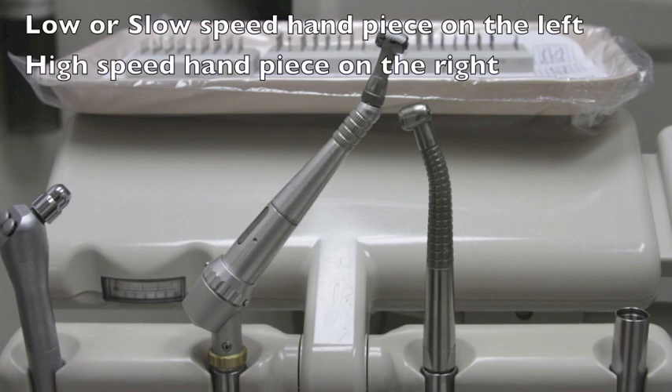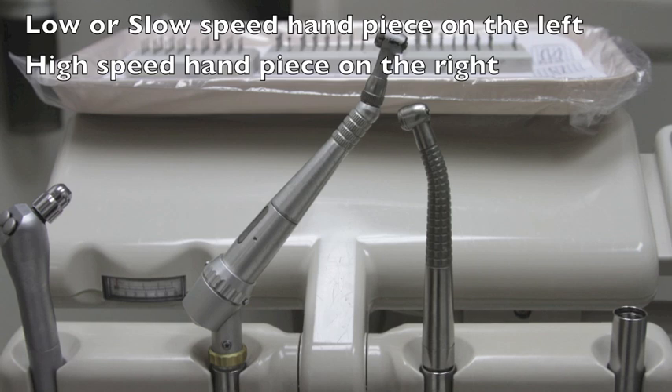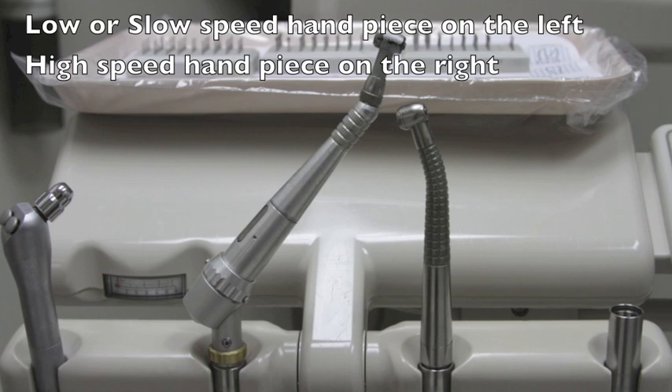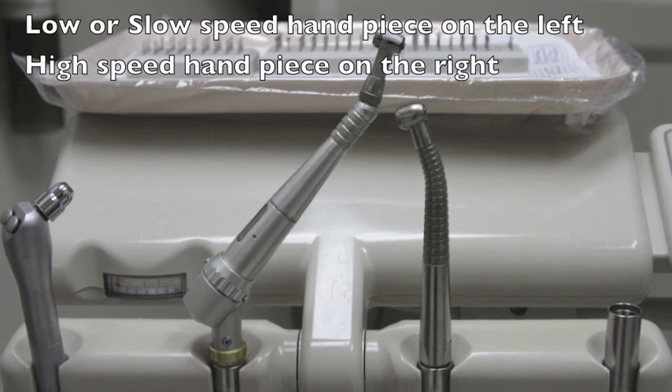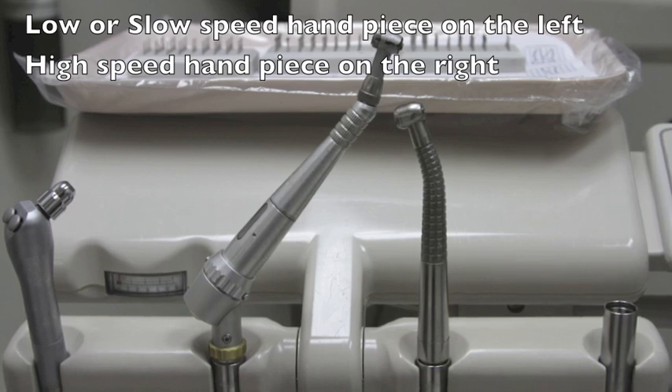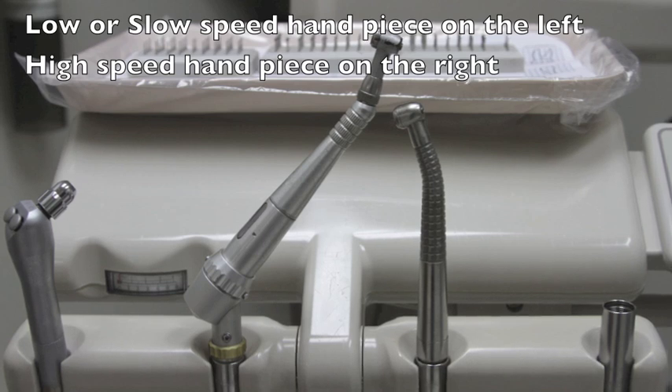Next we'll be looking at handpieces. As illustrated here, there are two common in dentistry. On the left is the slow speed handpiece and on the right is the high speed handpiece. Both are powered by air pressure and are used to turn dental burrs, whose function it is to cut tooth, or in surgical cases, to cut bone. The slow speed runs at about 8,000 RPM up to as high as about 30,000 RPM. High speed handpieces can run as high as 400,000 RPM, though at working speeds they are about 250,000 RPM.